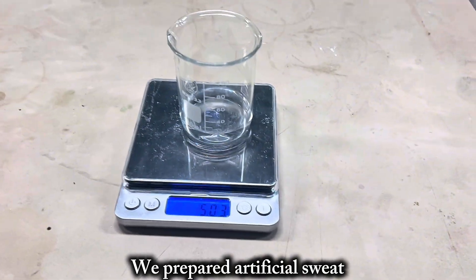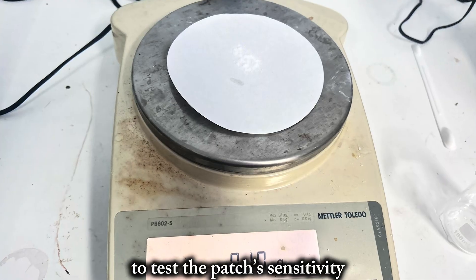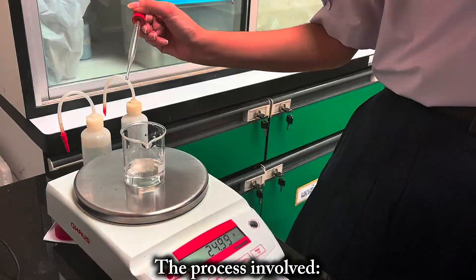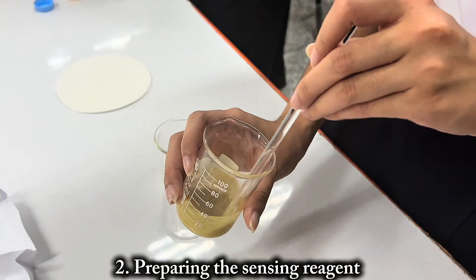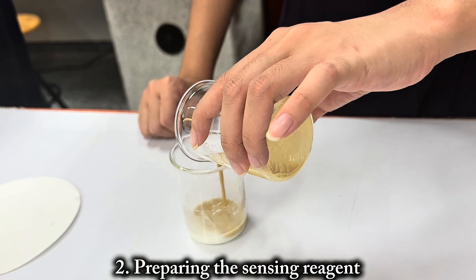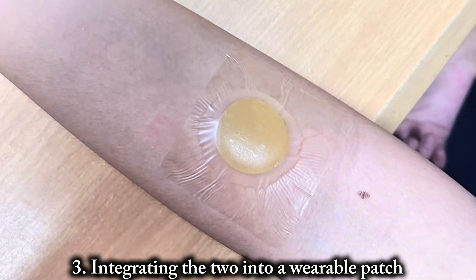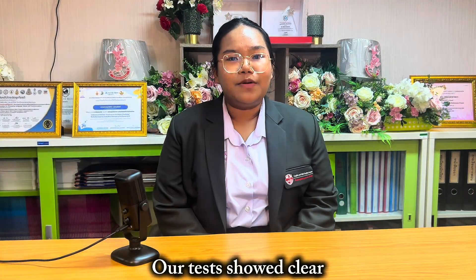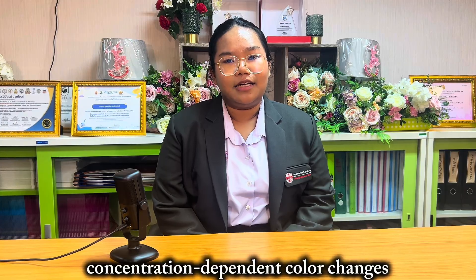We prepared artificial sweat with varying glucose concentrations to test the patch sensitivity. The process involves: 1) making the hydrogel base, 2) preparing the sensing reagent, 3) integrating the two into a wearable patch, and 4) testing the color change response type and intensity. Our tests show clear concentration-dependent color change.